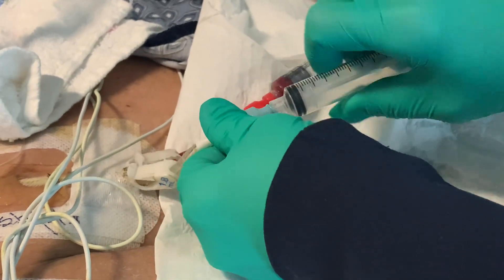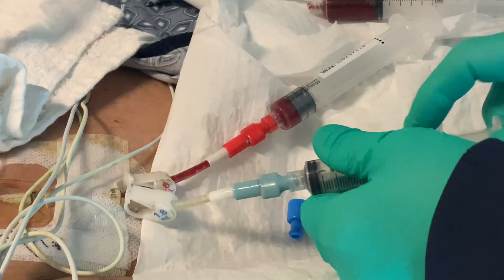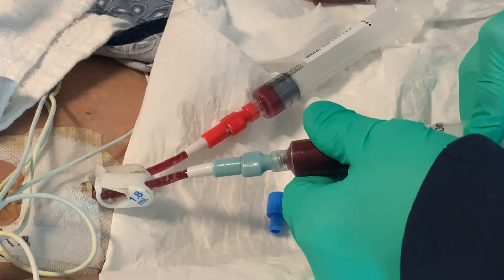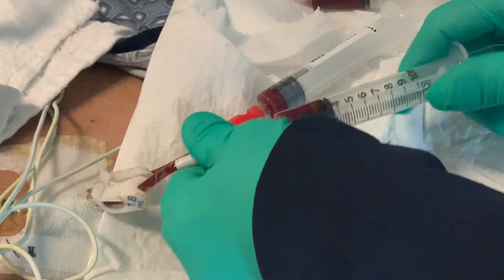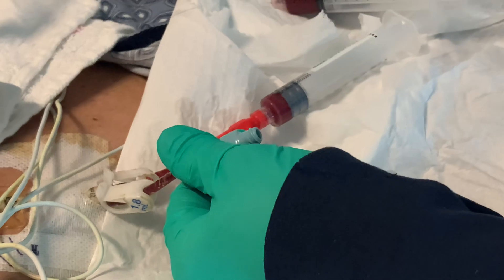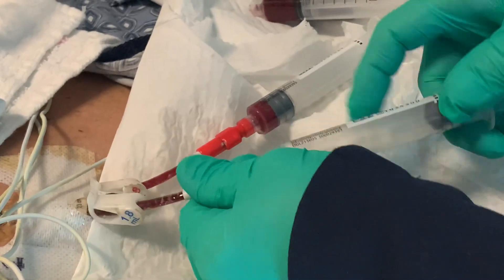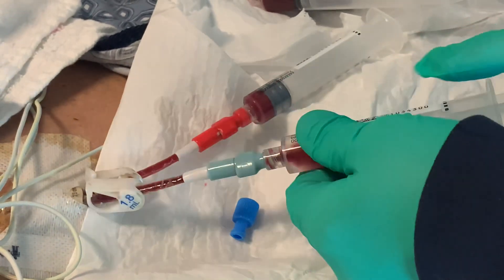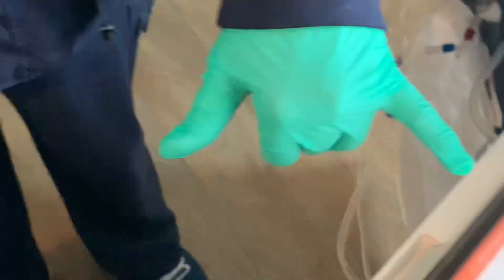All right, repeat the same for the other port. Drawing five cc's to make sure we get all our heparin out. Now testing our line with our saline flush. Feels like butter, right? Soft like butter. No resistance.